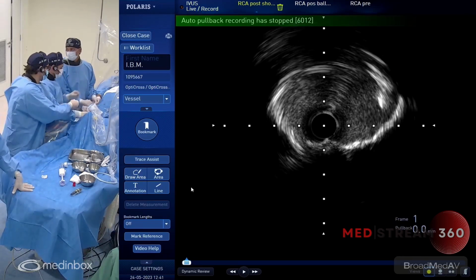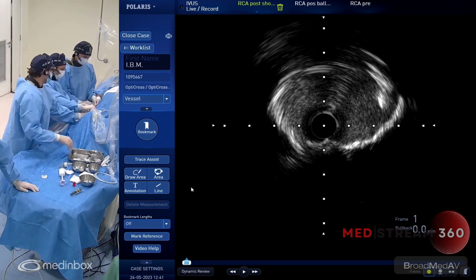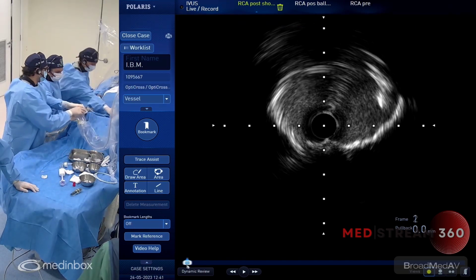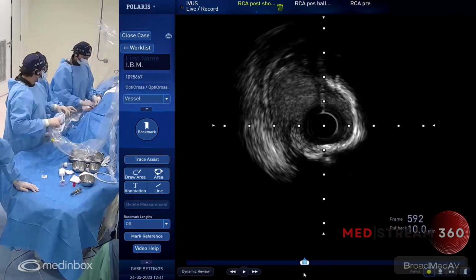Do you think there are some calcium fractures? I do see some plaque fracture. I can get back here to show. I think it's important just for Rodolfo to try to make his decision now.